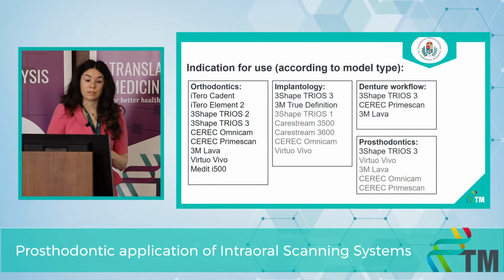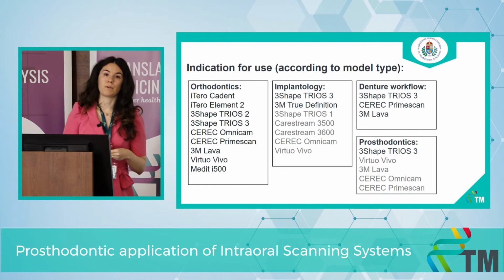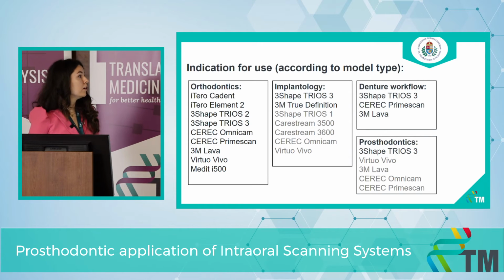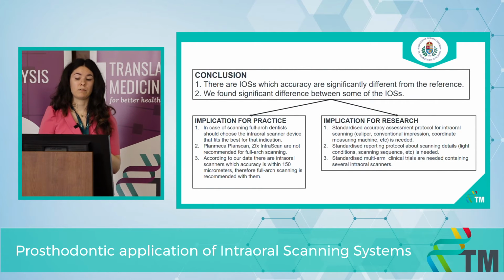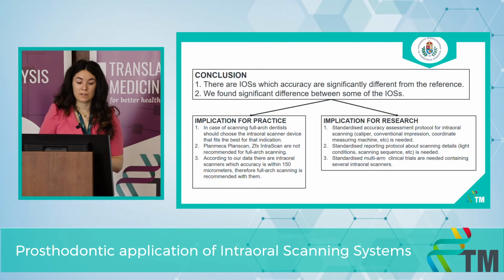According to the model types, we can give indication for use for dentists. So in this case, we can suggest scanners for orthodontics, for implantology, for the denture workflow, and for the prosthodontic workflows as well. Thus, for conclusion, we can say that we found, in some cases, significant differences between the intraoral scanners and between the reference.